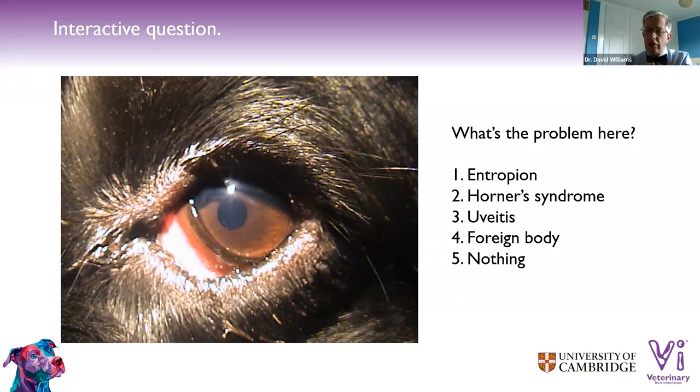When you come to cut this, if you pull down that lower lid with your thumbs, you can see how much you have to pull down, and then you can make a little picture and say, maybe that's half a centimeter's worth of skin you're going to have to take off there. And I'd always say take off less rather than more. Also, once that animal is anaesthetized, the irritation all goes completely, and you'll then be able to see better how much to take off.